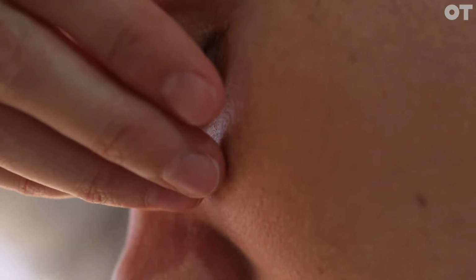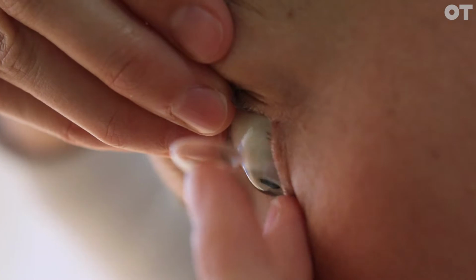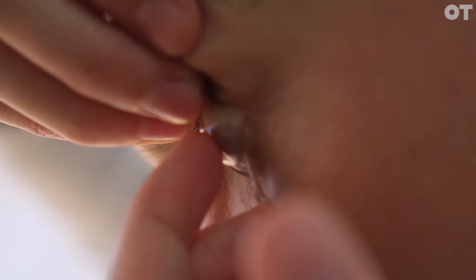Rather than just pulling the eyelid up, I quite often will say, well, think of it like a garage door, that the eyelid goes up and back over the eye. So you're trying to hold the lashes against that bone. So bring the eyelid up and back and hold the lashes against the eyebrow bone, and then you can't blink even if you want to, because the moment that lens comes towards you, you're going to want to blink. So if you can get those eyelids under control, you've got half a chance of getting it in.